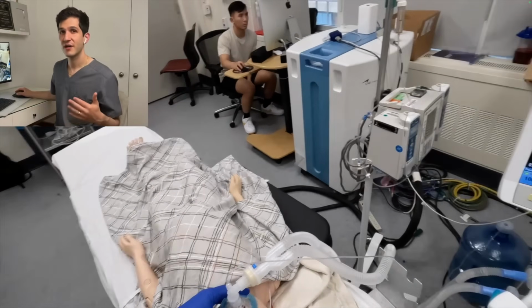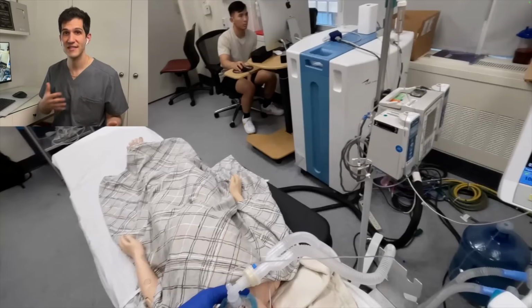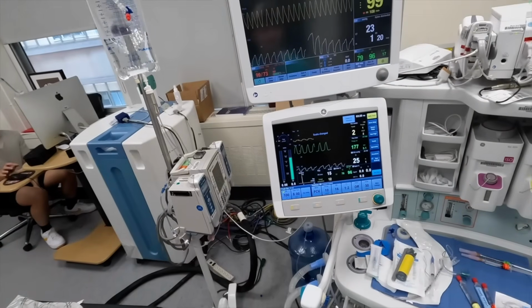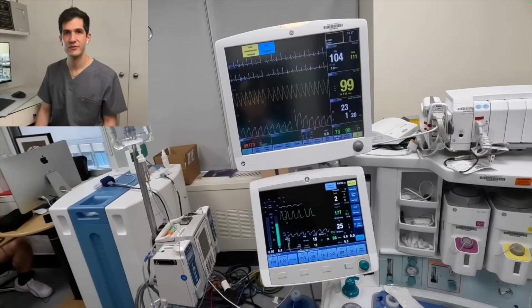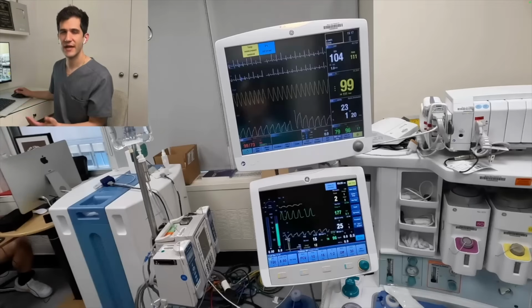During this process, I'm constantly panning between the monitors and the patient to make sure that all the vital signs look okay and to make sure that the patient's chest is actually rising and that they're clearly exchanging oxygen. Seeing the patient's heart rate increase is a normal part of undergoing an inhalational induction. So this is the beginning of that hyperexcitable phase. You can see that the heart rate's gone from where we started at 96 to now 104. So I expect to see this.